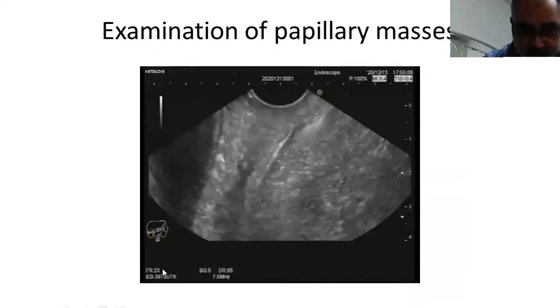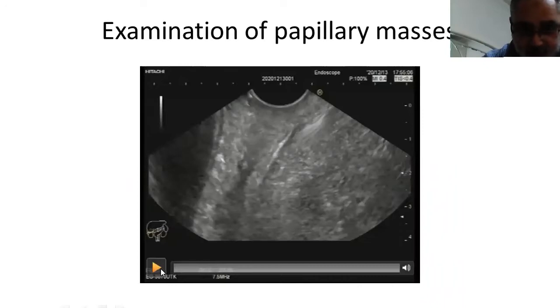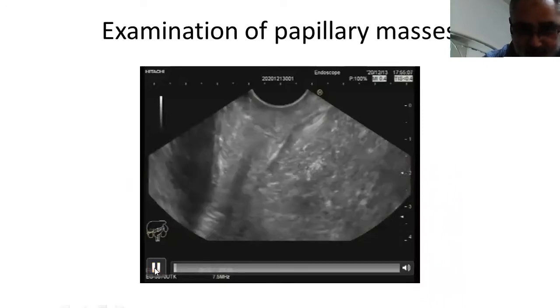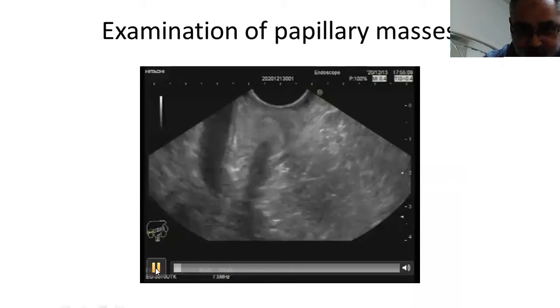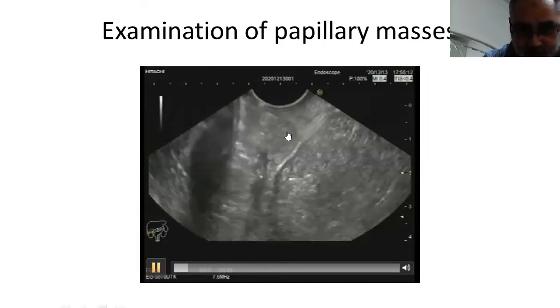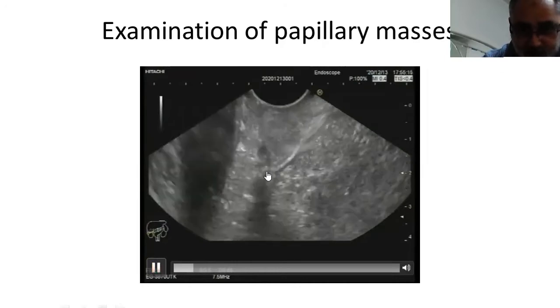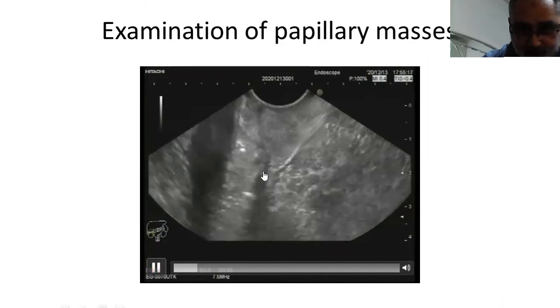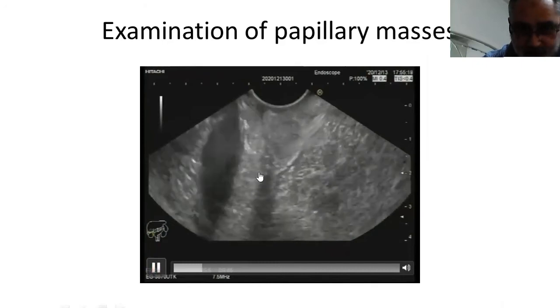In this video, this is the papillary region. We are now inside the lumen of the second part of the duodenum. This is the papillary region, and this is the muscularis propria layer. This is the abdominal aorta, and this is the lumen of the second and third parts of the duodenum with air inside. This is the papilla, this is the muscularis propria, and this is the lumen of the second part with fluid inside. This is the abdominal aorta.